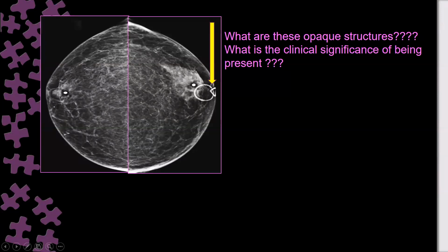These are skin markers, but which type of skin markers? Is it a single skin marker or more than one? What is the shape of these skin markers? Circle or triangle. Yes, so there are two. I expect you to ask me about the other view to see the exact location.